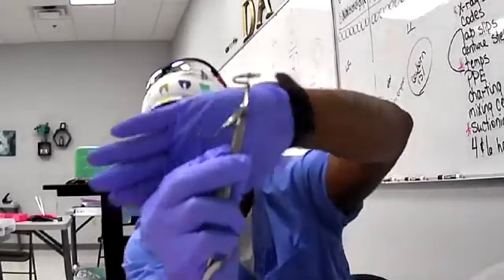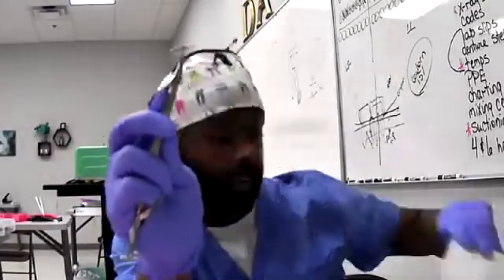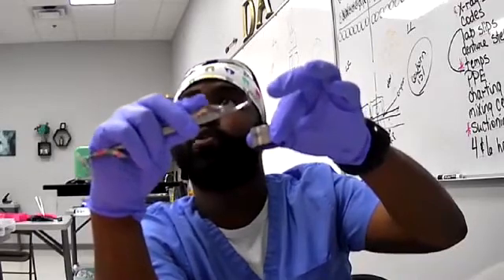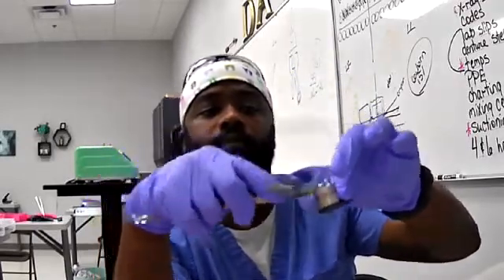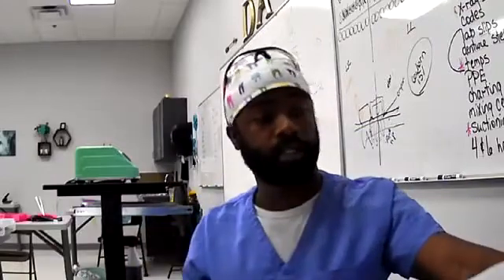I hold my finger under this part. That way, whenever I'm scooping the amalgam into it, it's not trying to close on me. So I put my finger under there, scoop the amalgam, switch sides, scoop it again, and you hand it off to your dentist.